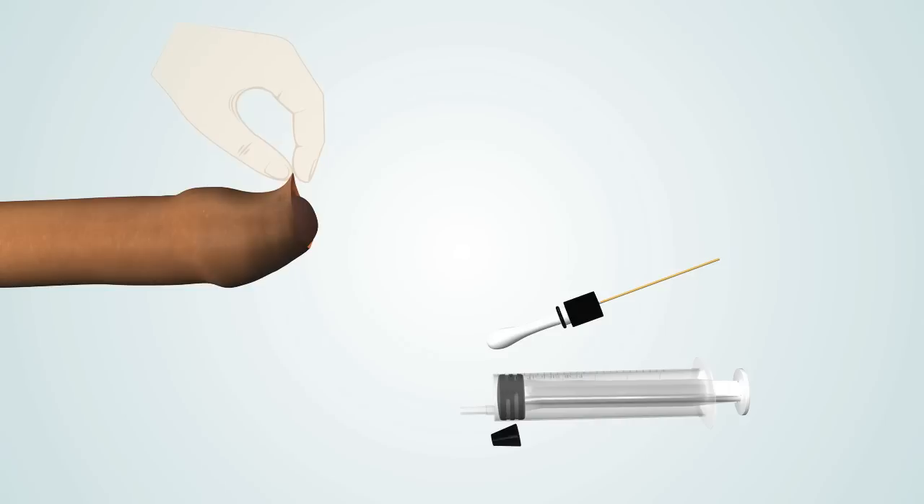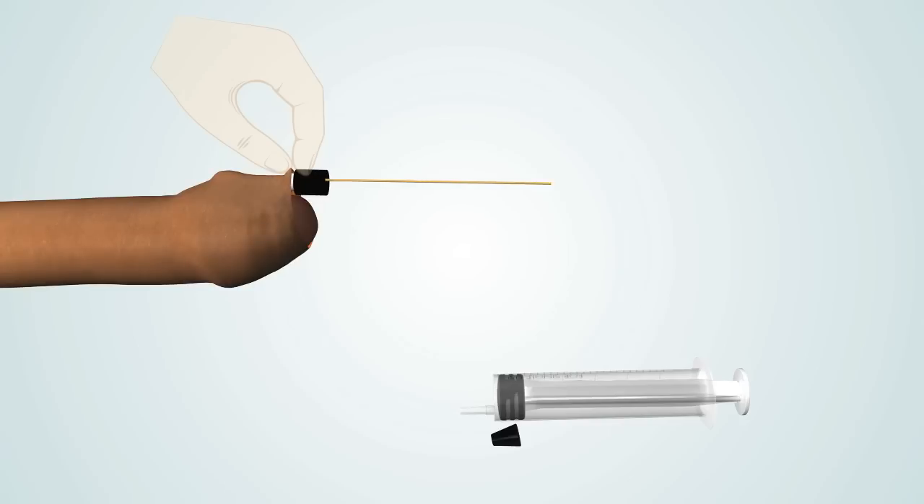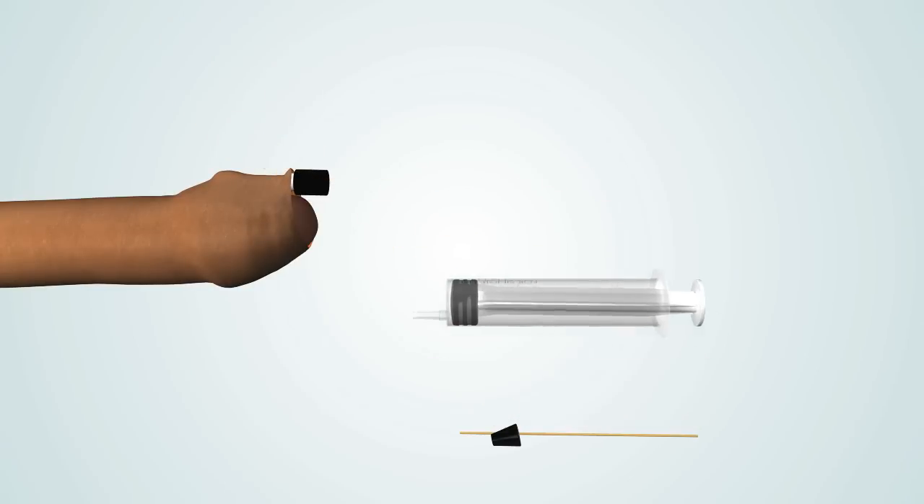Lift the foreskin of a flaccid penis up from the surface of the glans using your thumb and forefinger. Use the NovoGlan balloon insertion rod to guide the balloon through the opening in the foreskin and position the balloon under the foreskin, between the foreskin and the glans of the penis.